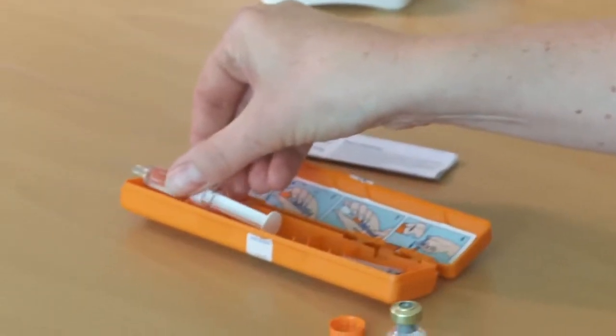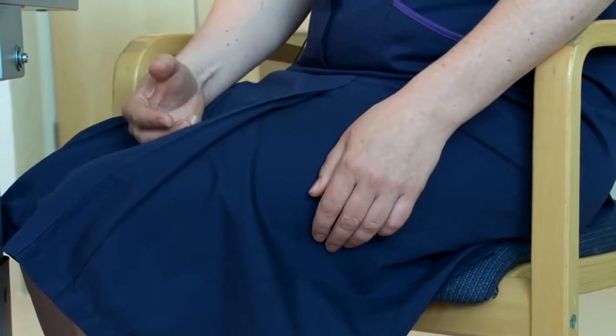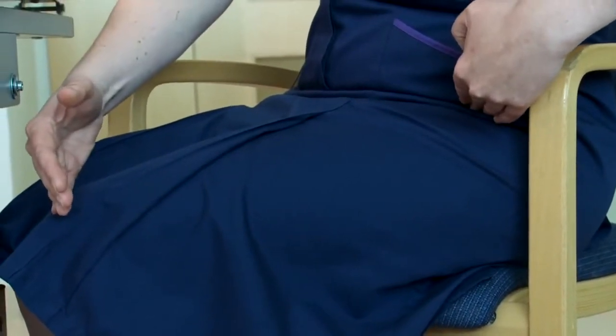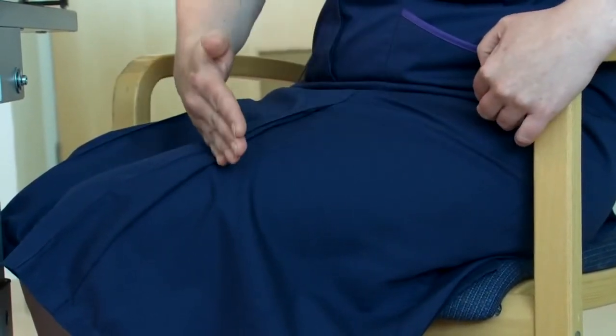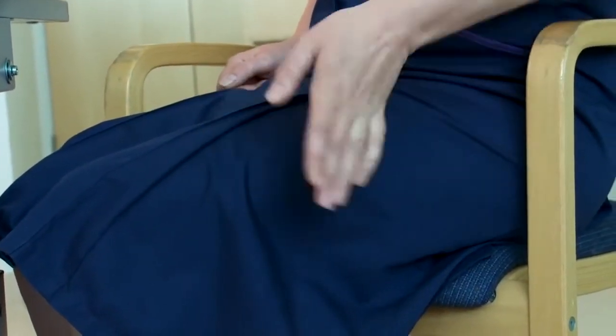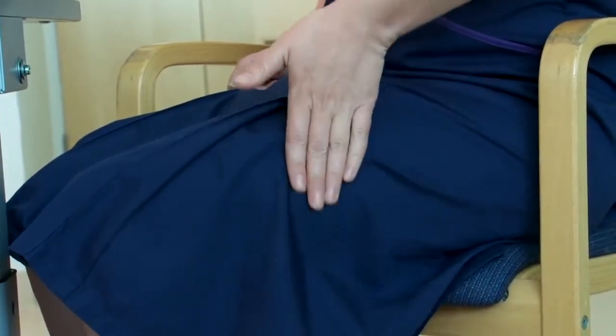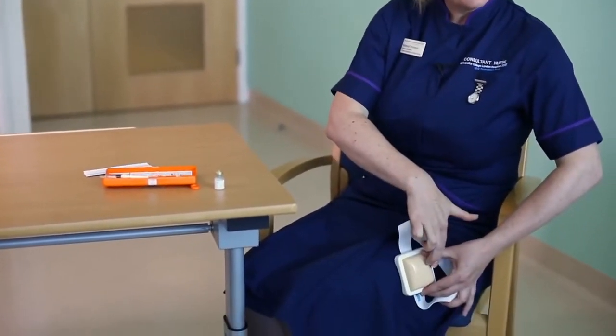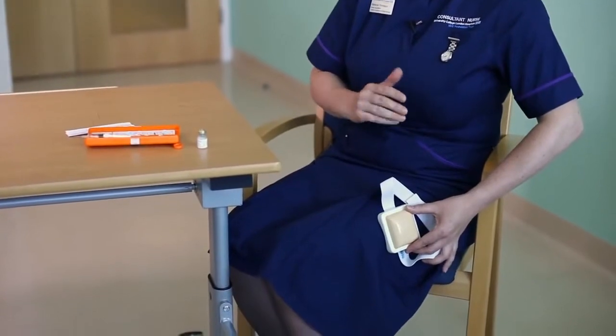So the glucagon injection needs to be given in a big muscle, and one of the biggest muscles is in the leg. So if you look at the leg and visually imagine your leg from the hip to the knee in 3 sections. So 1, 2, 3. The glucagon injection needs to be given in the middle section on the outer edge. So if I was doing an injection on me using this injection device, if I placed it on my leg here, I would be doing the injection here. I'm going to demonstrate this with this on the table.